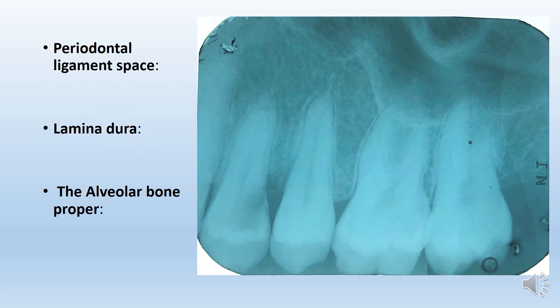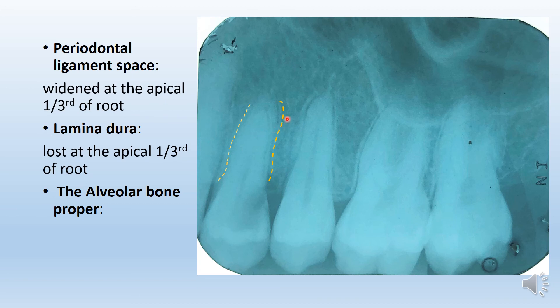Next, it is important to identify the periodontal ligament space. When looking at the periodontal ligament space, you will see a black line along the tooth demarcated by the yellow line. In this radiograph, you can see that at the apex of the tooth, that yellow line is no longer visible — this is the area where you have widened periapical periodontal ligament space as well as loss of lamina dura. The lamina dura is the white line, and the periodontal ligament space is the black space between the white line and the cementum of the tooth root.